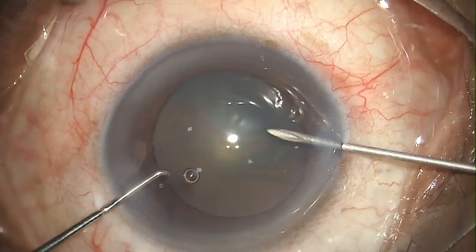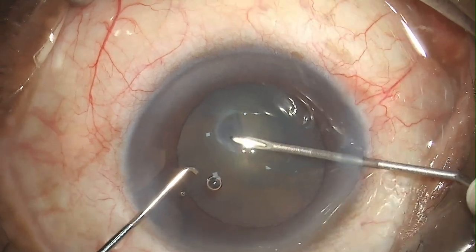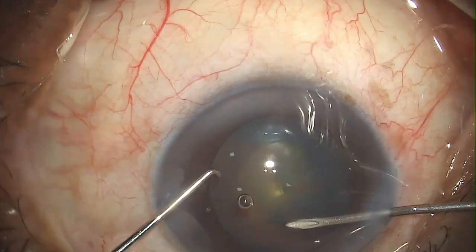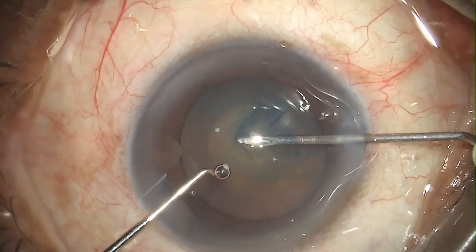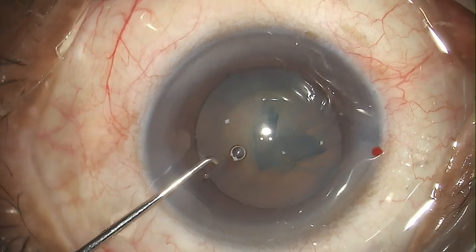Going for the capsulorrhexis with a 26-gauge bent needle. In such soft cases the rhexis usually tends to run out, just like any other total or hypermature cataract, so you have to be careful with it. I was extra careful, so I ended up with a smaller rhexis in this one.